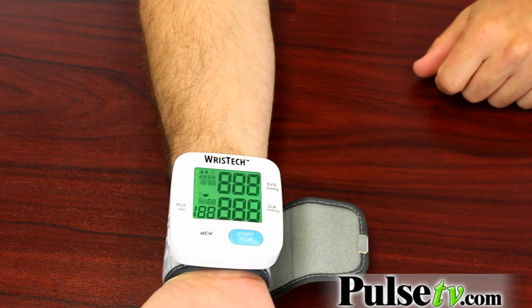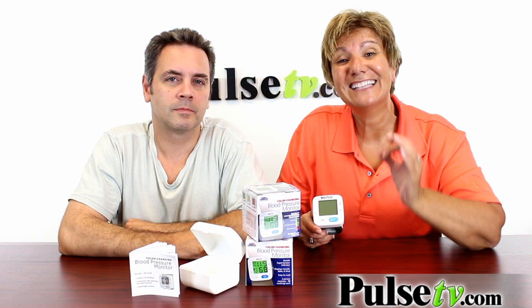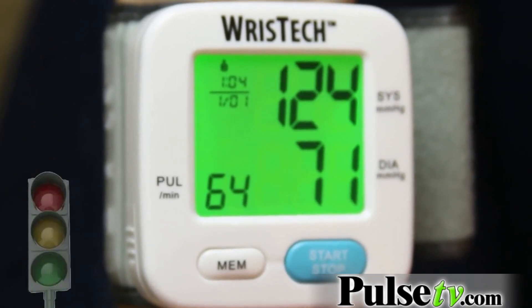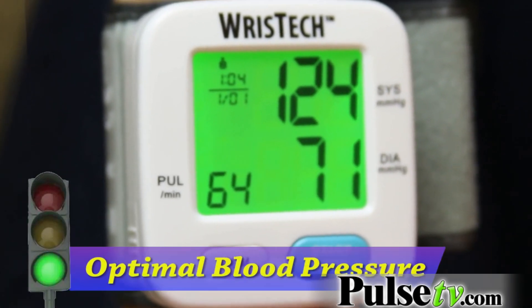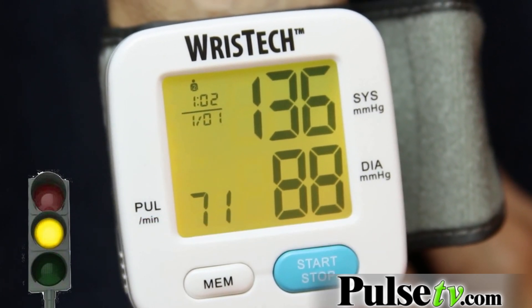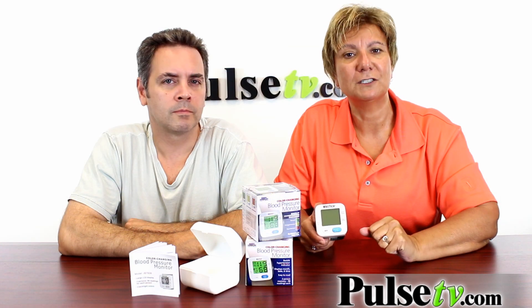Another convenient feature, and why I love this better than any other one I've ever used, is the screen is actually color-coded. The screen will light up in green, which means you're normal; yellow, which means you're probably a little pre-hypertension; or red, which means you want to monitor it and make sure that it doesn't spike up too much every day.